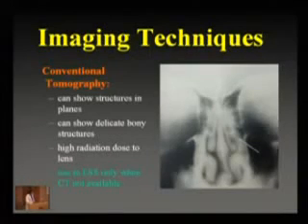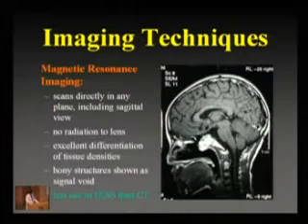Perhaps this is one step forward, that we can see tissue in planes when we are doing traditional tomography. But the problem with this is that there's a lot of radiation received by the patient to the lens and to the thyroid glands and so on. And that's why, unless CT is not available, traditional tomography, again, is not very applicable in FESS.